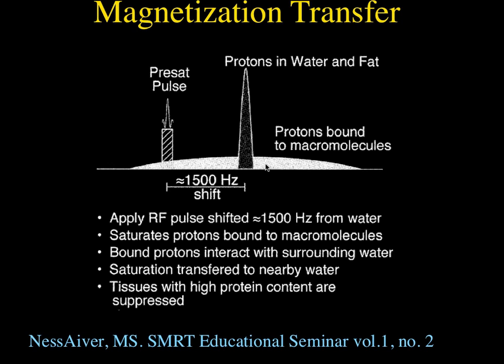As such, they tend to resonate at a different frequency than the main water peak, primarily due to shielding electrons.